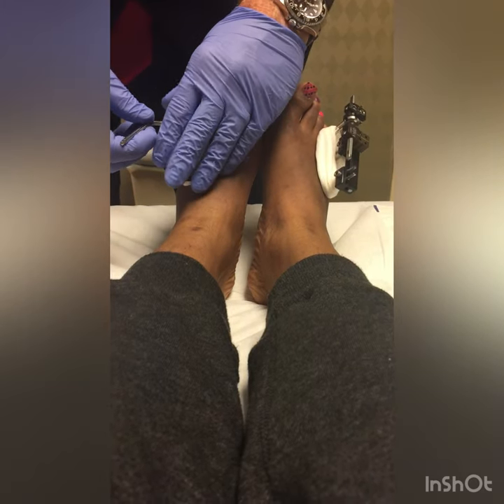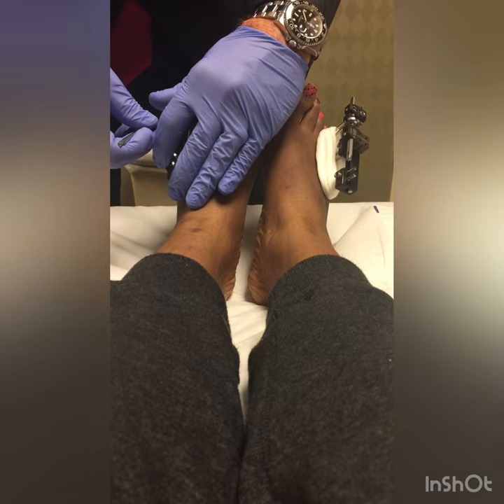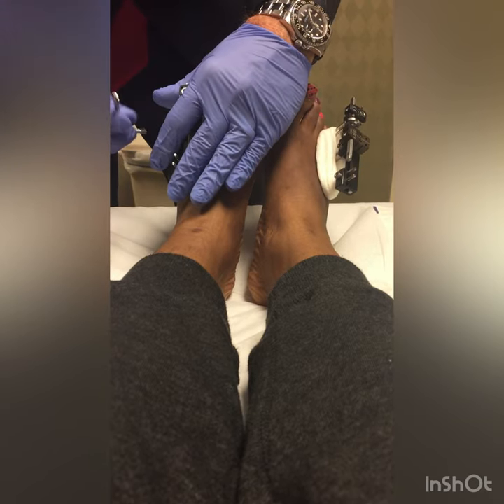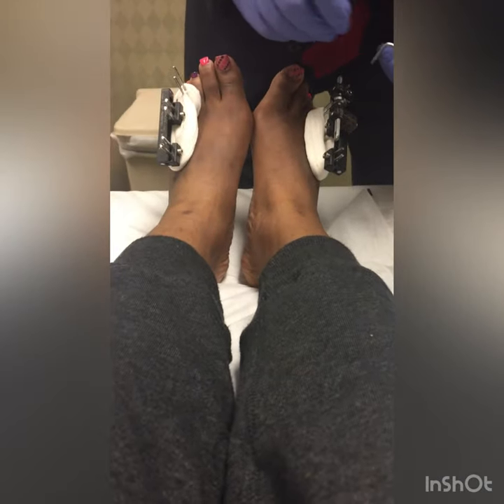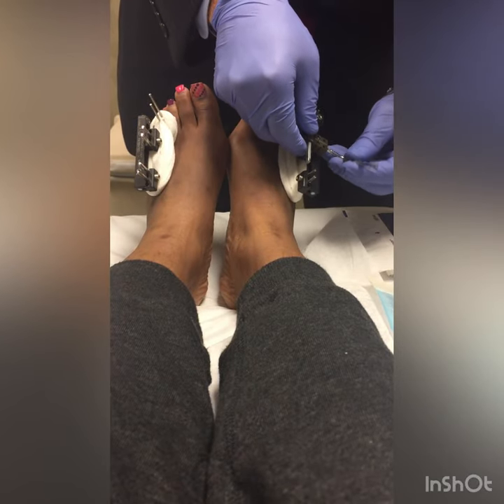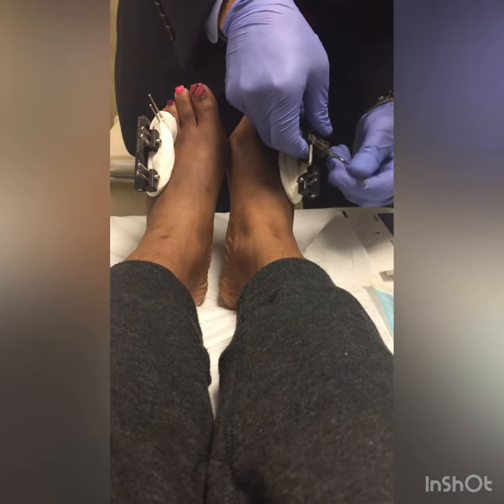This is the easy part where we're just loosening up the outside. This is the joint distraction portion.